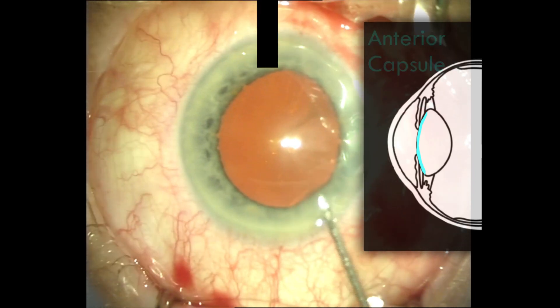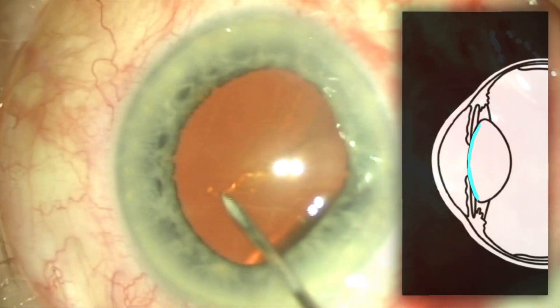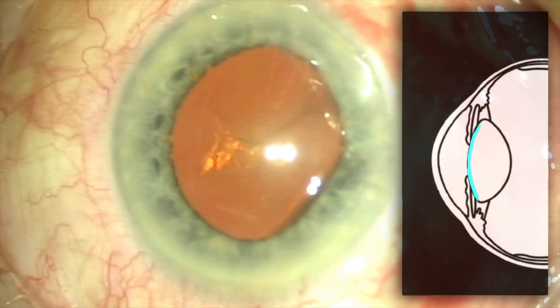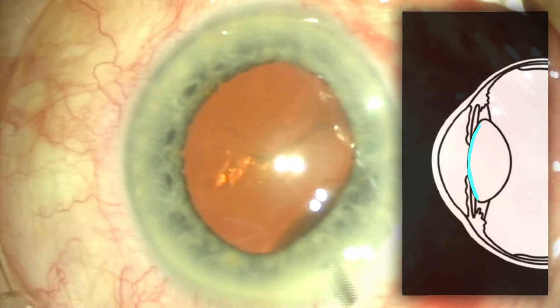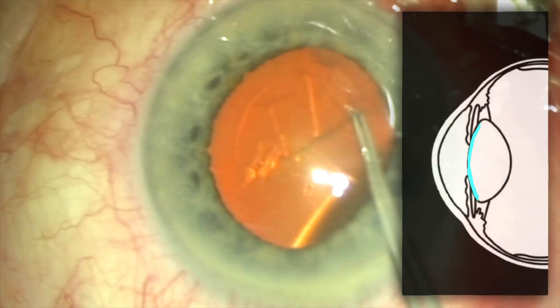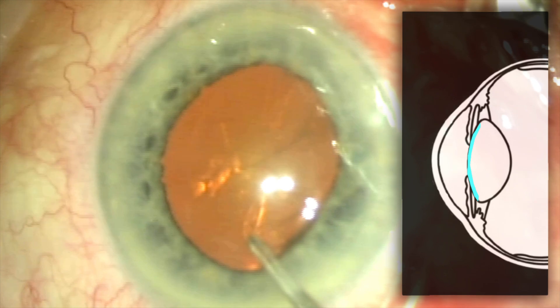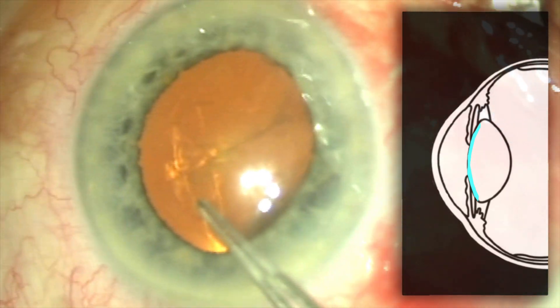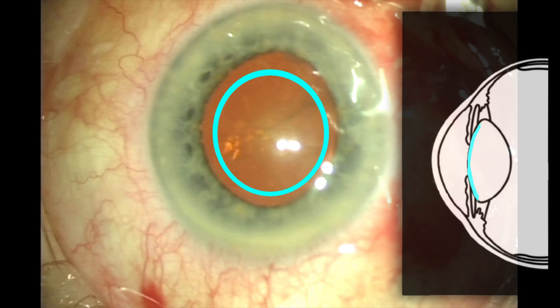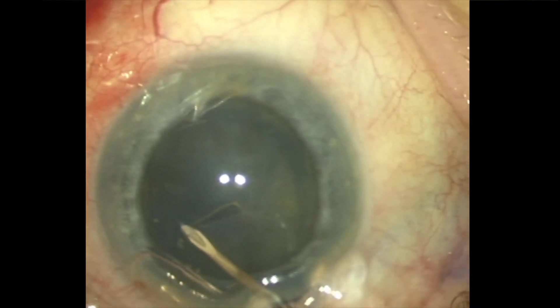The next stage is performing a continuous curvilinear capsulorhexis. I'm using a 25-gauge needle to puncture the capsule and lift a small flap. I'm then using forceps to pick up the flap and pull it around slowly to create access to the cataract. Ideally this needs to be about 5 to 6 mm in diameter and centrally located. The capsule is a basement membrane rich in type 4 collagen and it's quite difficult to see in this video, so I've included another video of a case where I've used vision blue dye to stain the capsule blue.